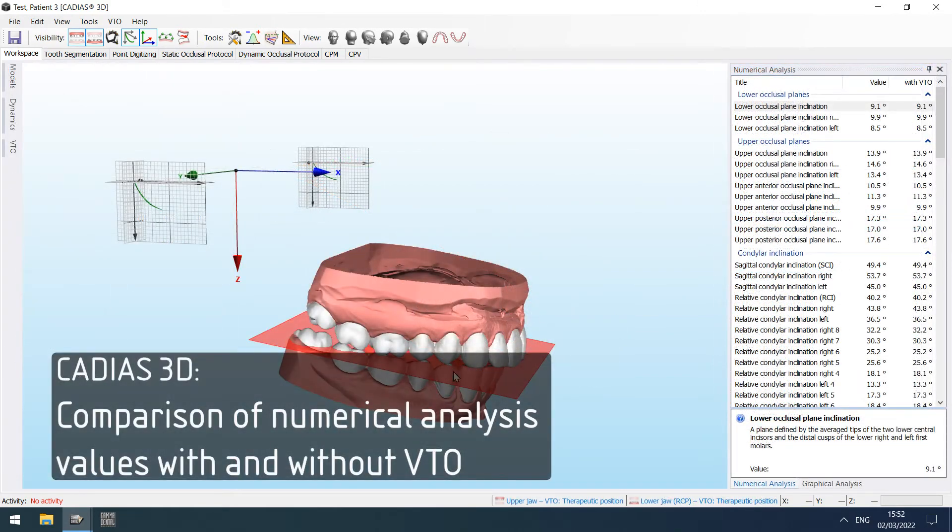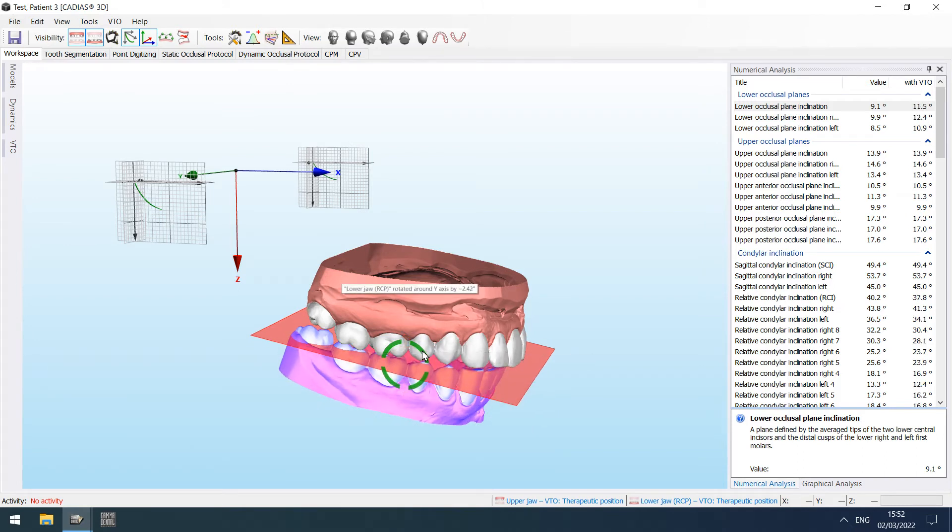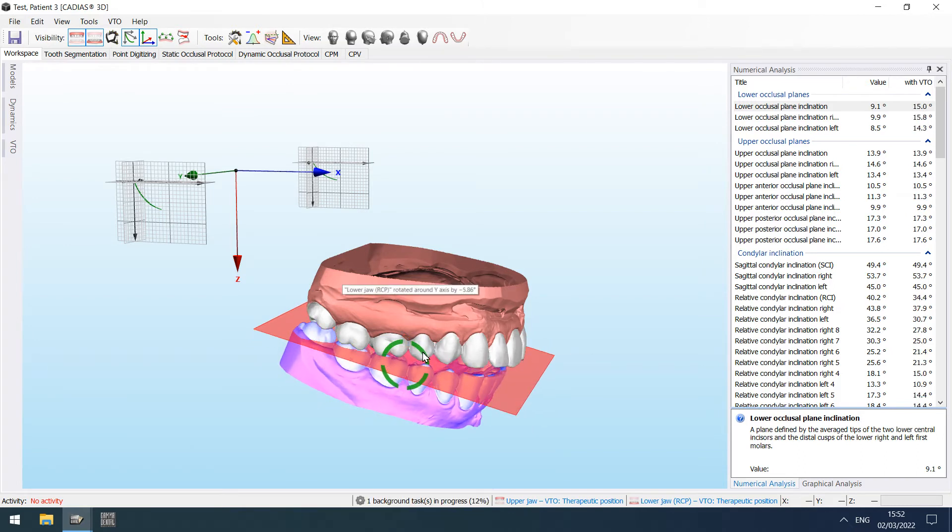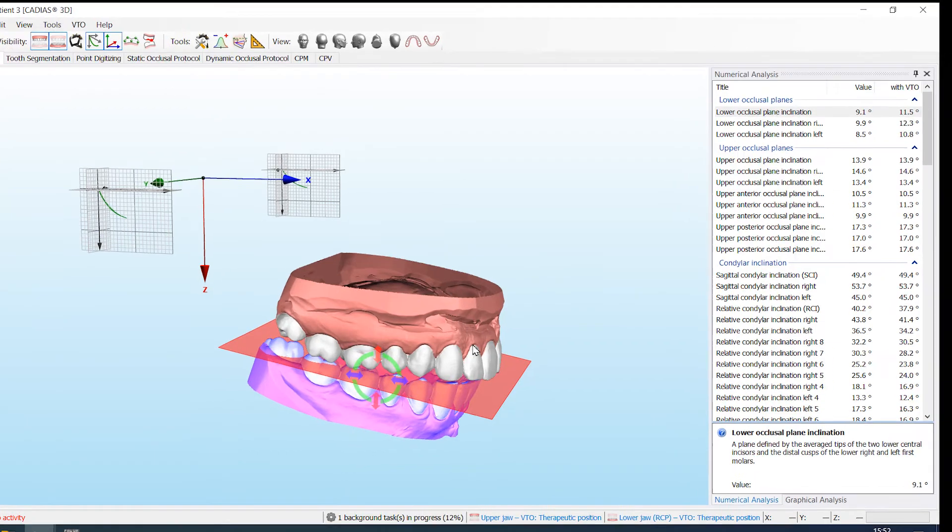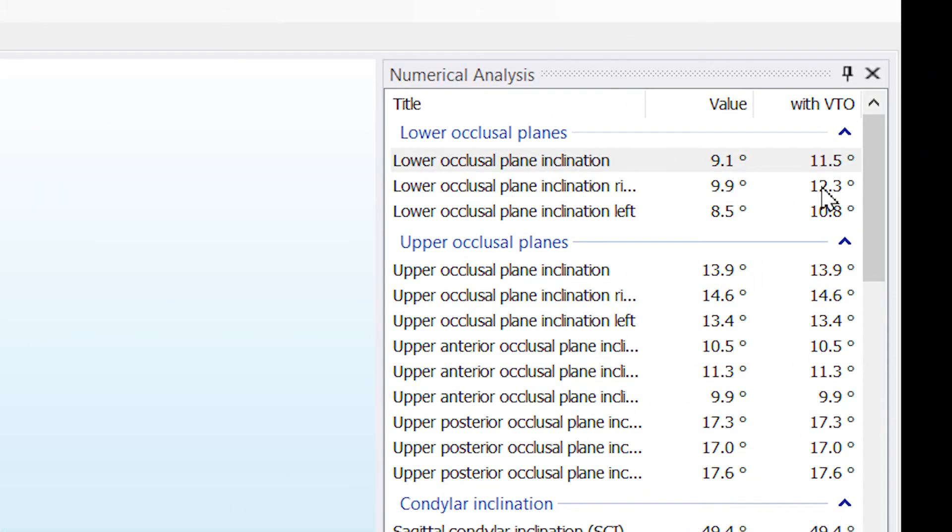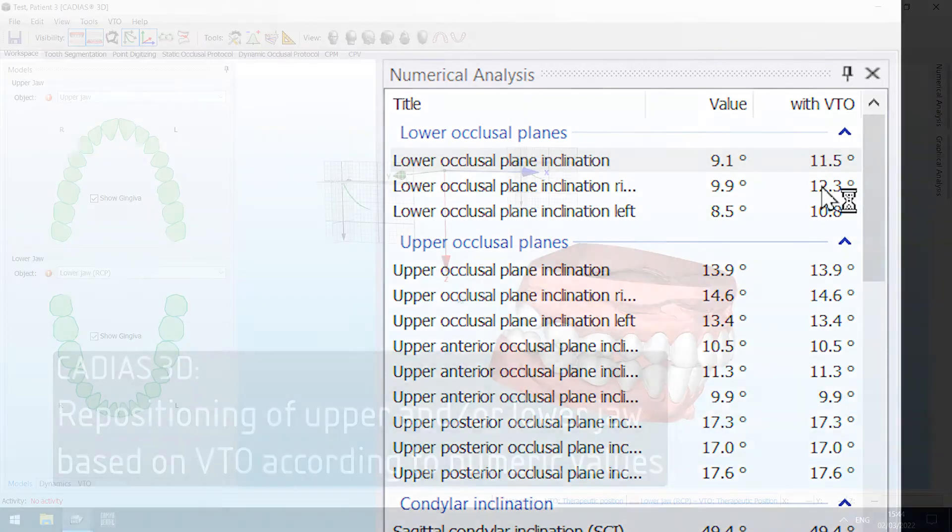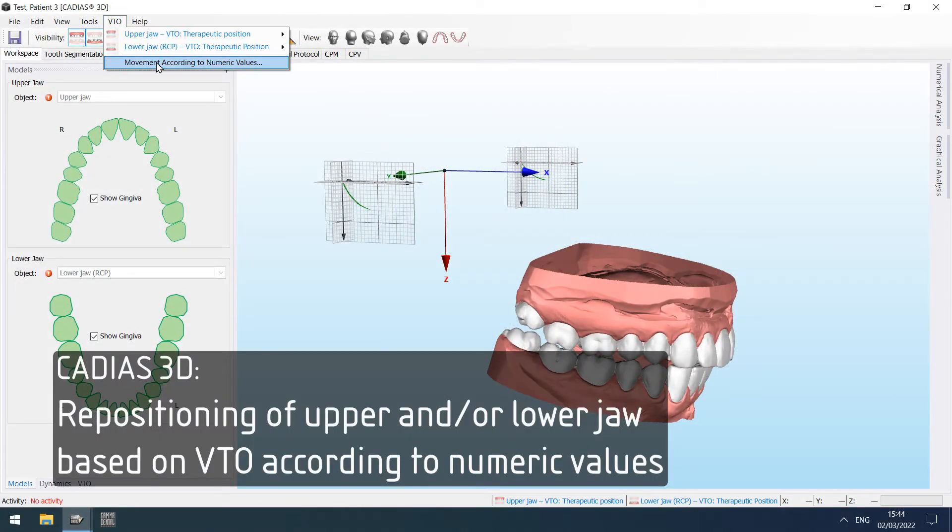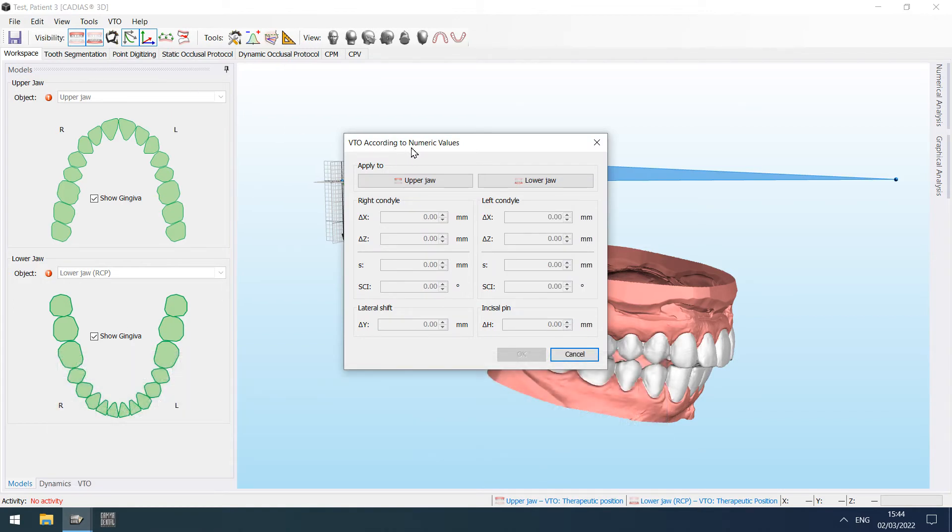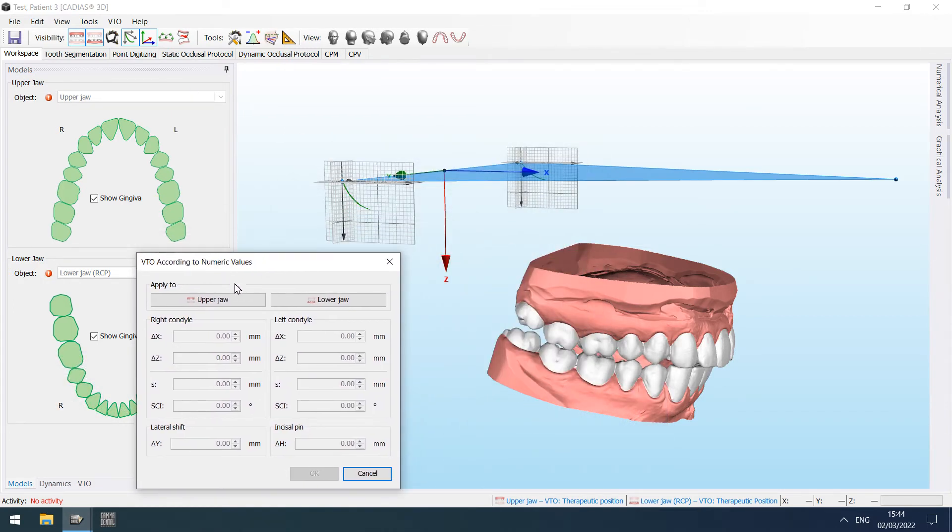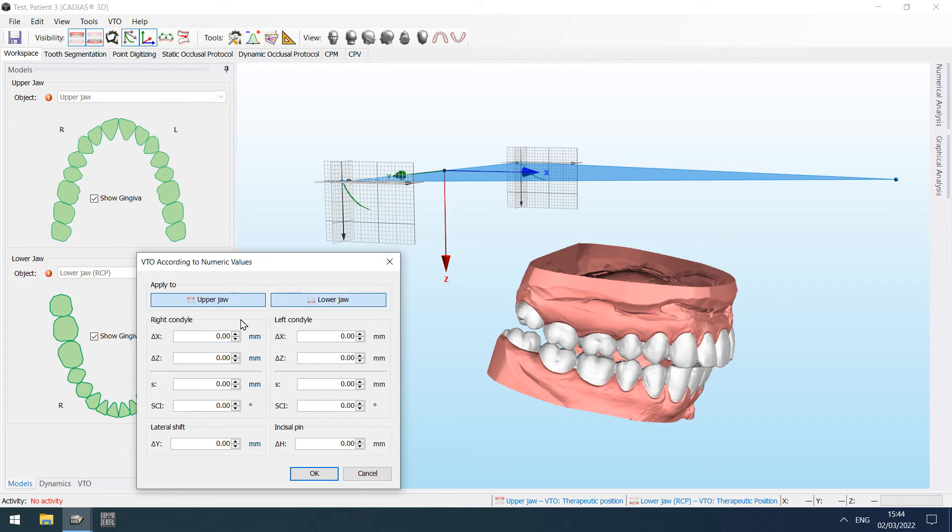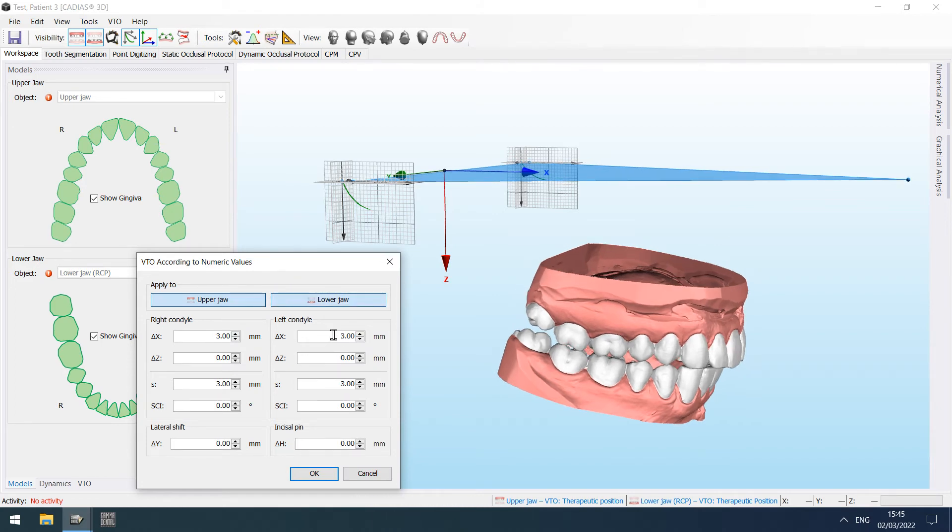When virtually repositioning models or teeth using the VTO functionality, the numerical analysis will now show a second column for easily comparing the values before and after VTO. It is now also possible to apply a VTO based on a numeric condylar offset and change of incisal pin height, either to upper or lower jaw model or to both models simultaneously.